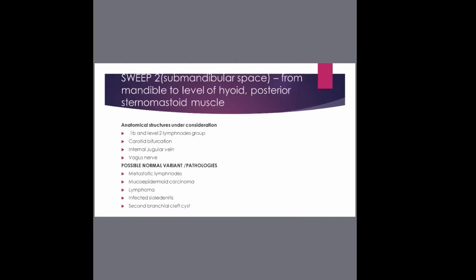Or when you scan and you feel, I'm not too sure that this is thyroiditis, it's up to you. You can state on the report that the machine you're using is not a color Doppler, so it's an inconclusive examination. That's up to you. But I know in Nigeria, if you do that, you will not get referrals. They'll go to other places, isn't it?